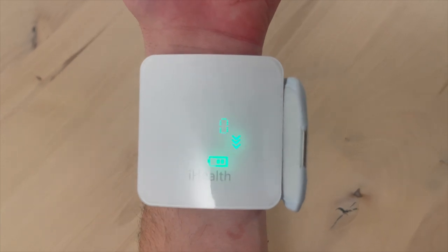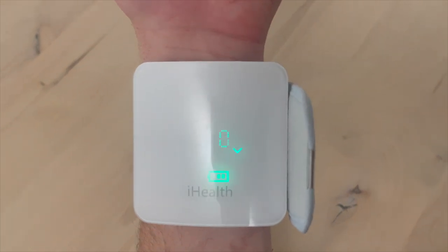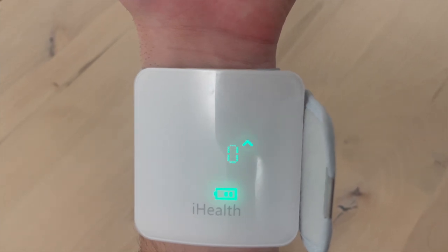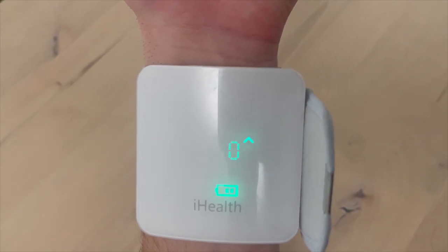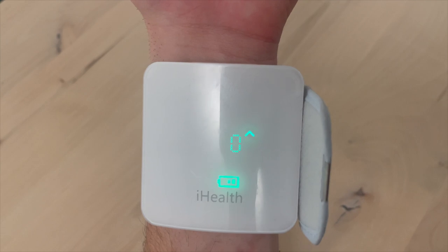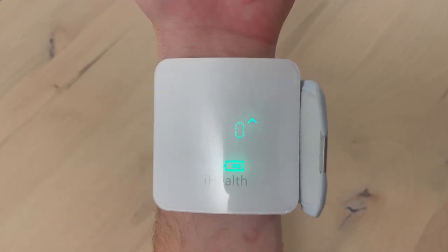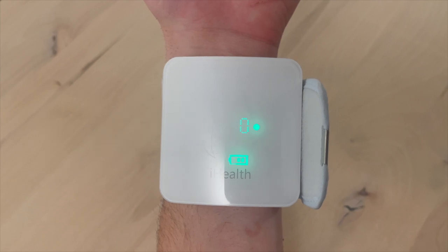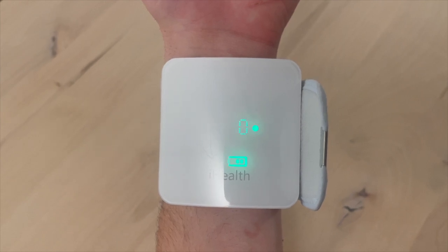Once you relax, sit with your elbow on a table in front of you and hold your lower arm up into the air. This device is designed to only take readings when the device is level with your heart to ensure accuracy. If your device is too high above the heart, up arrows will appear on the display. If the device is too low below your heart, down arrows will appear. You can't take a reading when these arrows appear.